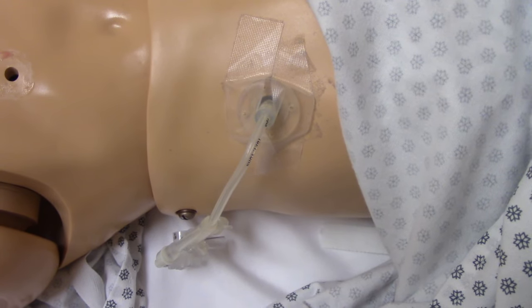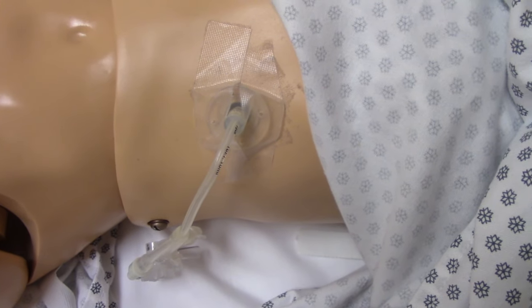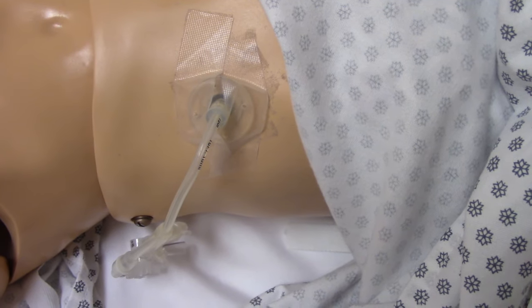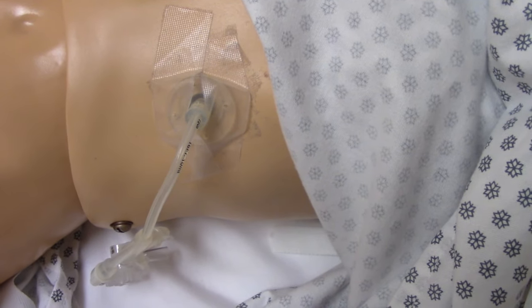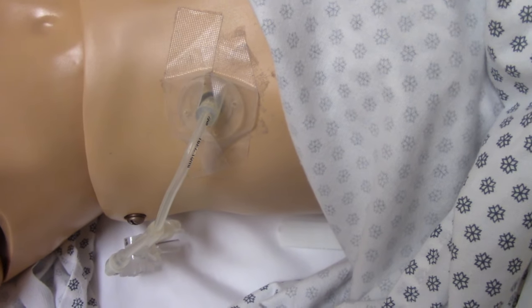We want to assess the G-tube site before we give a med through it. When assessing the site, we're looking for skin breakdown, any signs of infection like redness or swelling, and making sure everything is attached as it's supposed to be. On a mannequin it's taped down, but on a real patient it's typically sutured.